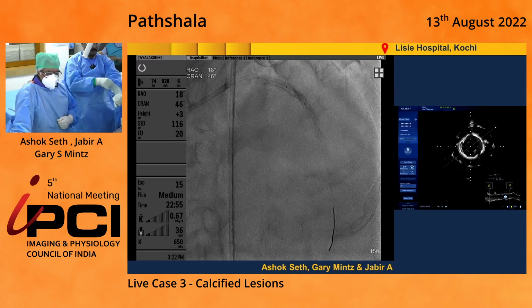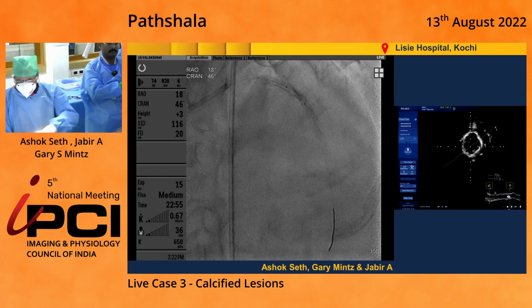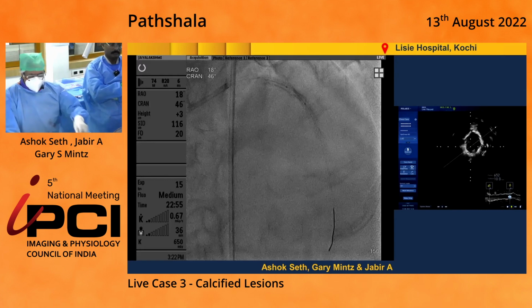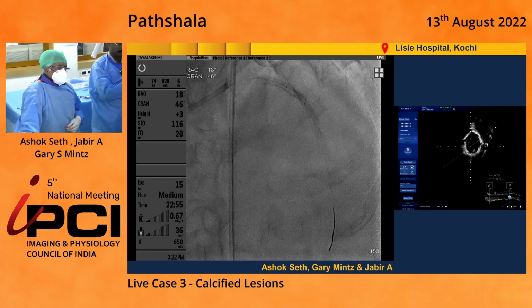The emitters are at 2 millimeters and then 6 millimeters. The distance between the two emitters is 6 millimeters, and then there's a final 4 millimeters to the distal marker. So the proximal emitter is eccentrically placed. They're not central, they're not equidistant. And therefore, let's show you a couple of images, the previous runs.